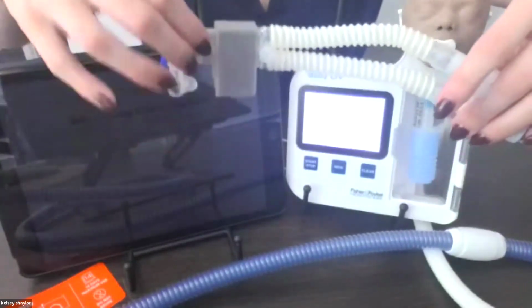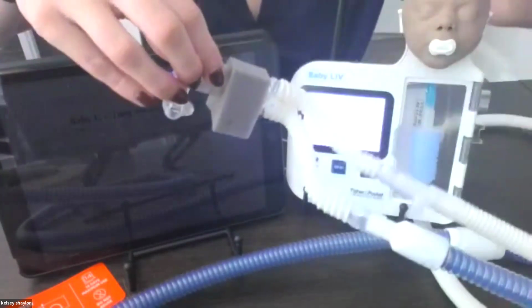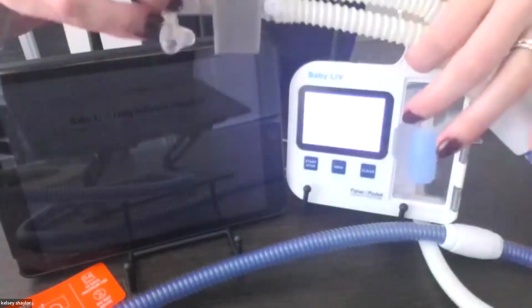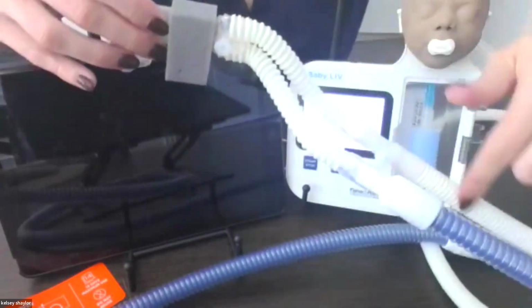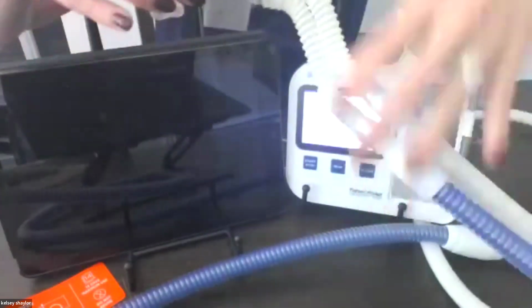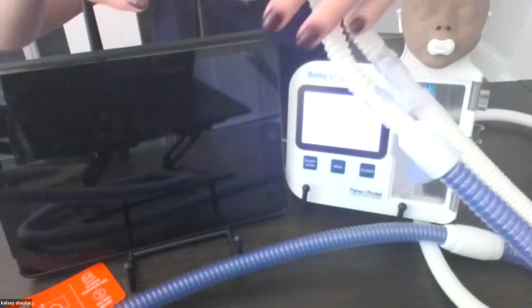The seal is an obvious one. As he was mentioning, you're either going to have prongs that fully occlude the nares, or you're going to have a mask that creates a seal. You're also going to have large tubes. These tubes are about the same size as the circuit, so we're not having any resistance to that pressure we're trying to deliver.